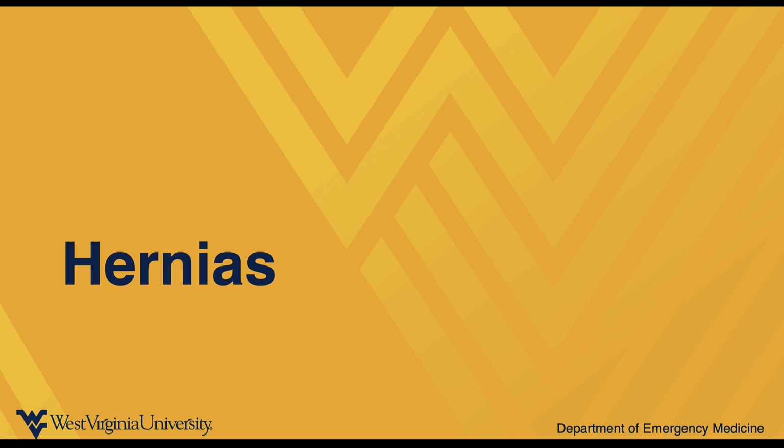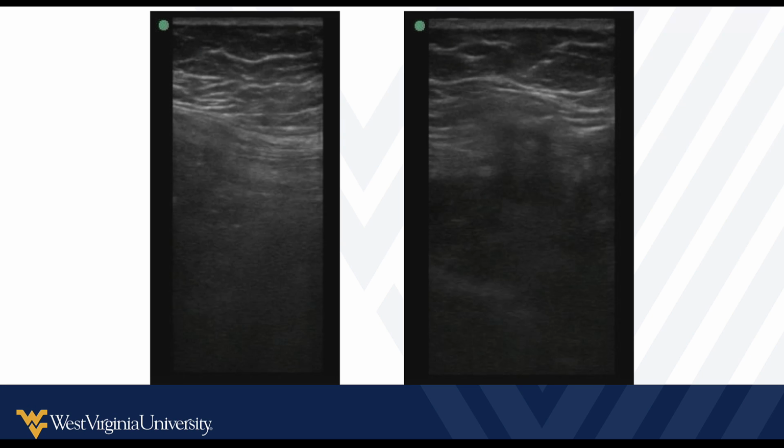So with that, we're going to take a quick look at some hernias. I think this is a super relevant, high-yield thing to be looking at in surgical patients or patients where surgical evaluation is requested. We're going to look at some examples and then we'll go to that case.